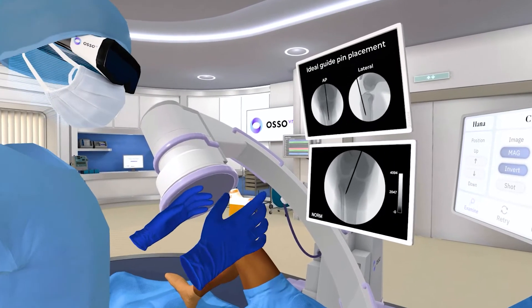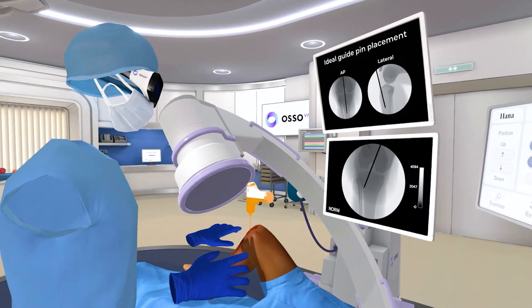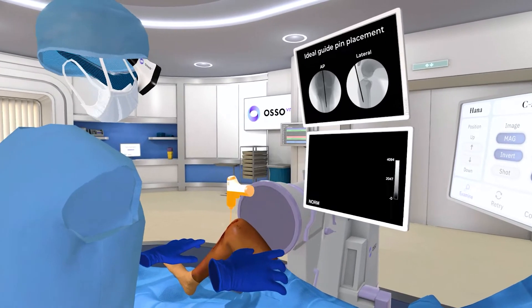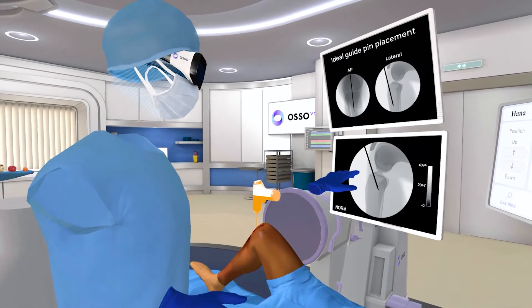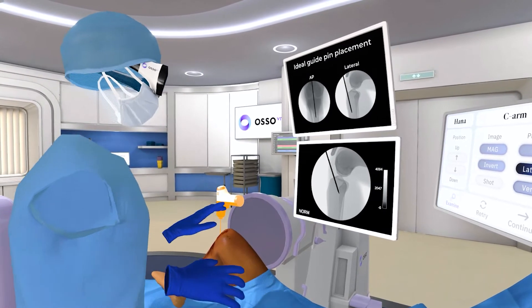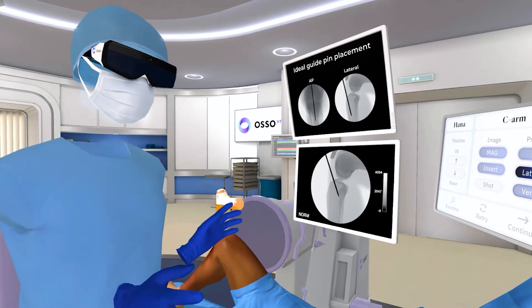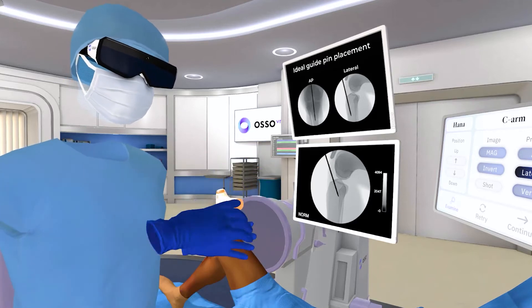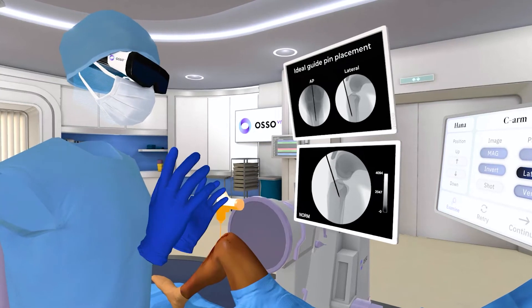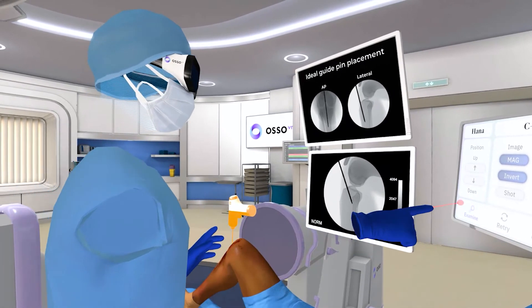This is shooting out the lateral side of the bone. If I look at the lateral view here, I think this might look okay — but actually it's shooting a little too posterior and I'd want it to go more anterior. You can look at one of these images and think it looks fine, but if you don't check the other image, it could actually be in a wildly inappropriate location. This is a very important skill for people to get down, even sometimes at advanced phases.